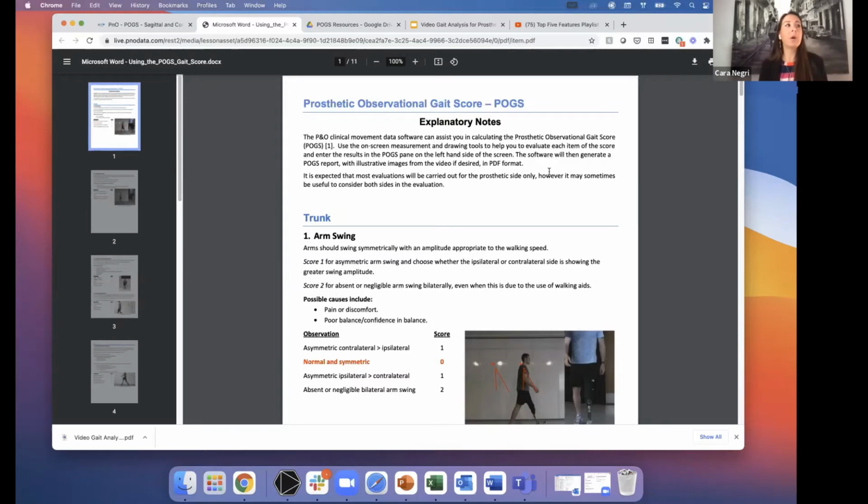The EVGS is validated for cerebral palsy, and I've seen that work has been done for validation with stroke, but I have not seen it published yet. I just saw it as a presentation once. So Rachel, I will go back to the QR slides at the end.